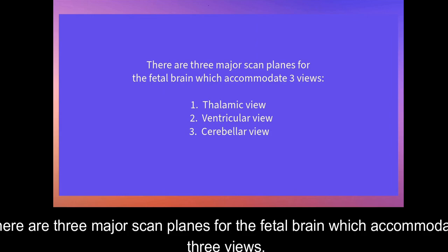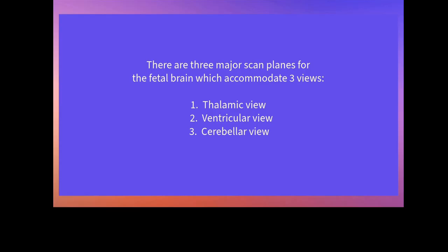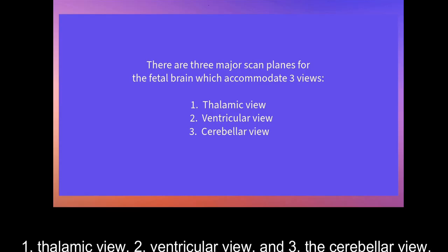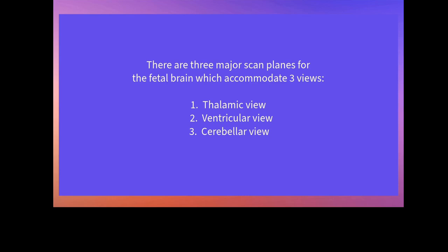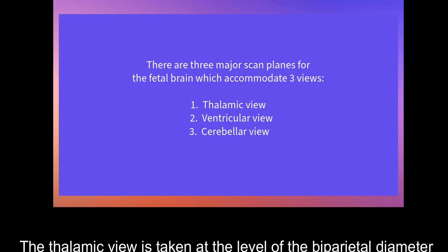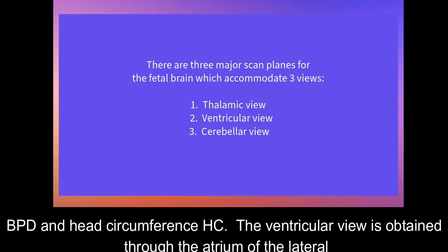There are three major scan planes for the fetal brain which accommodate three views: 1. Thalamic view, 2. Ventricular view, and 3. The cerebellar view. The thalamic view is taken at the level of the biparietal diameter, BPD, and head circumference, HC.